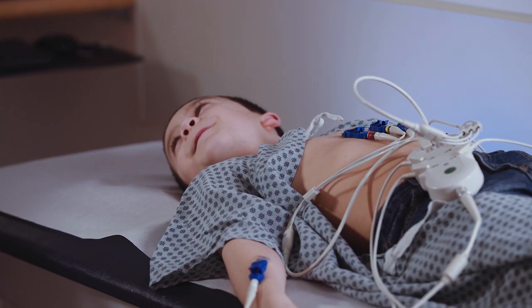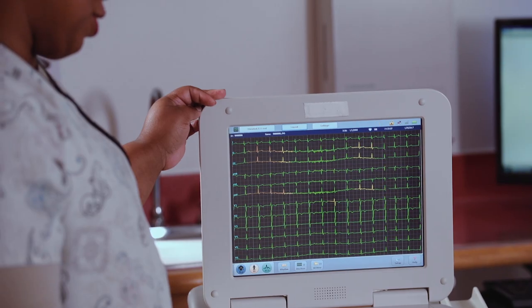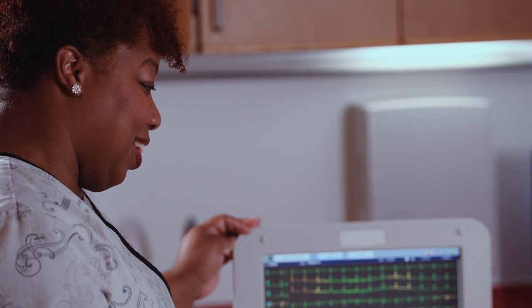Next, you'll be asked to hold still and breathe normally. On a monitor, you'll be able to see what your heartbeat looks like.